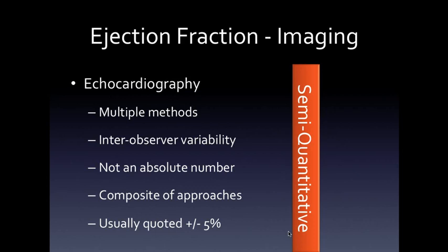And also, what should be done in a good core lab is that maybe 10% of echoes are read twice. So I think there's this idea that there will be a little bit of interplay between different readers. I think as clinicians, some of us like to be sensitive. We like to kind of pick up disease really early, and some of us like to be specific. We kind of want to wait until there's a problem. We kind of have that hardwired into us.